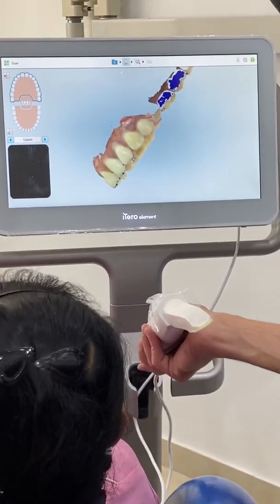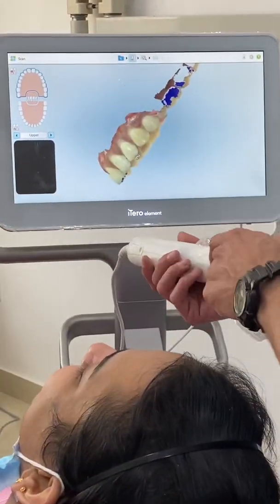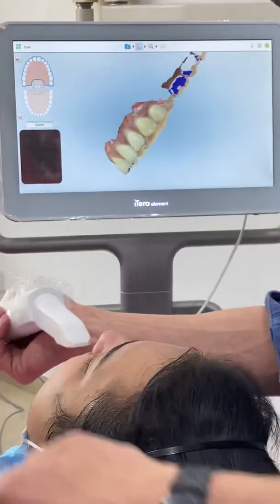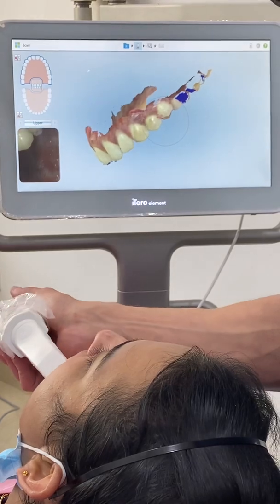Say something, do something. If it's hurting you, push me, yell, give me any sign. Okay. We're almost done anyway. Just need that last part, then we're good.